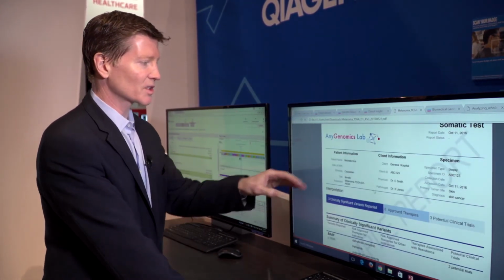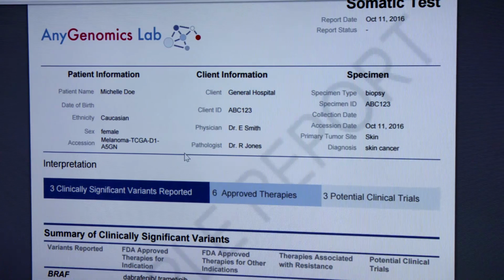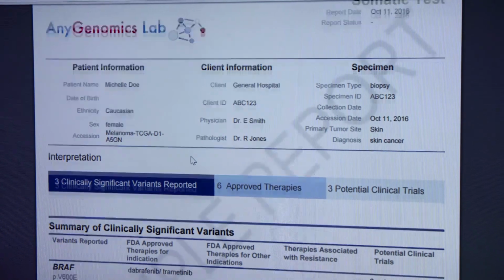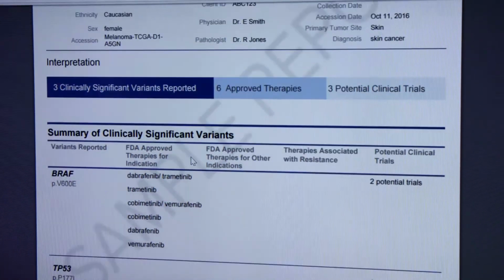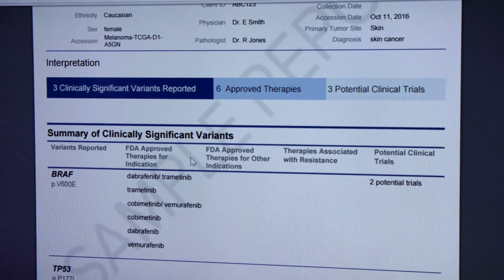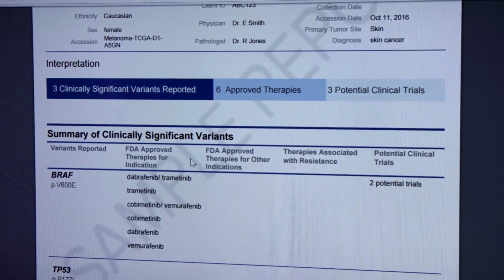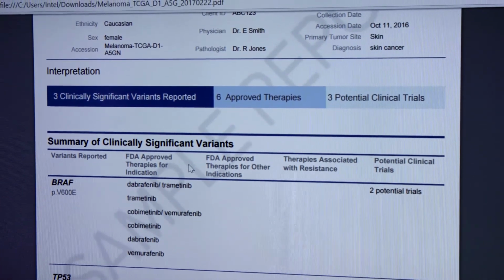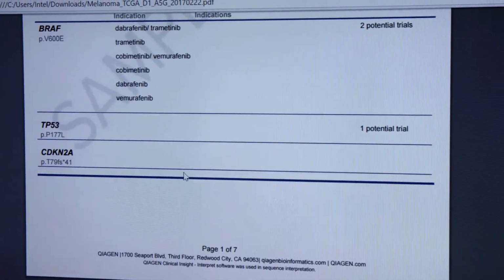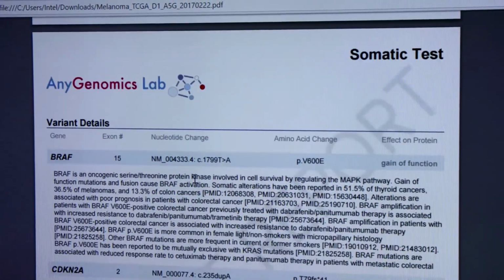We provide all the patient clinical metadata as well as specimen DNA, RNA material information that it would typically be reported out. And then everything we reviewed within the application that's being interrogated from a clinical decision support perspective, we're presenting on a physical report that a physician and/or counselor can review.